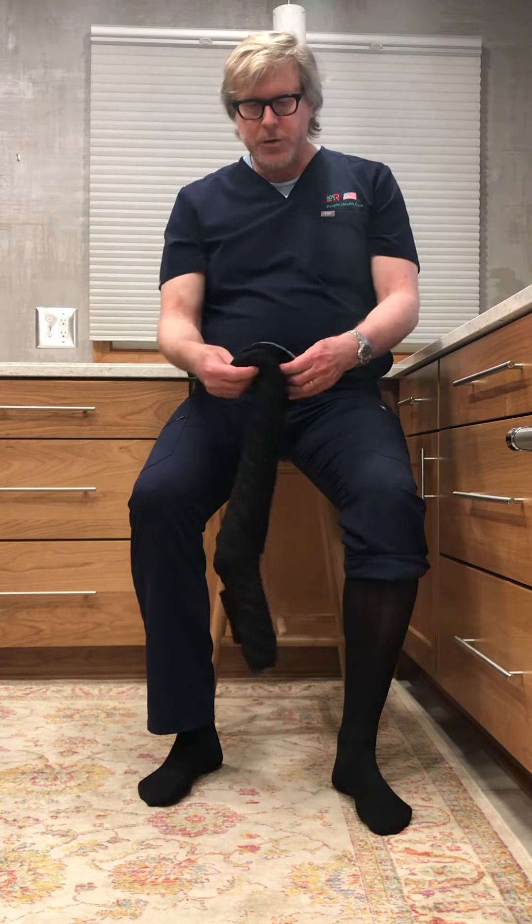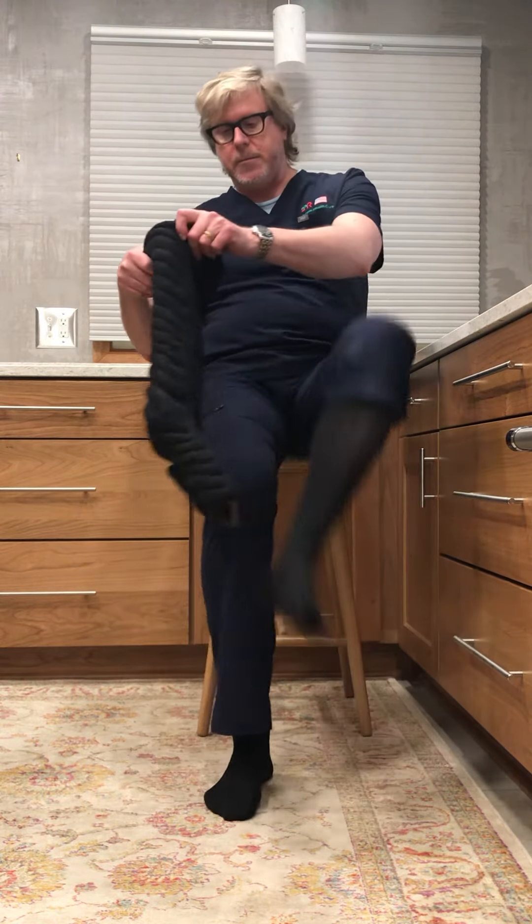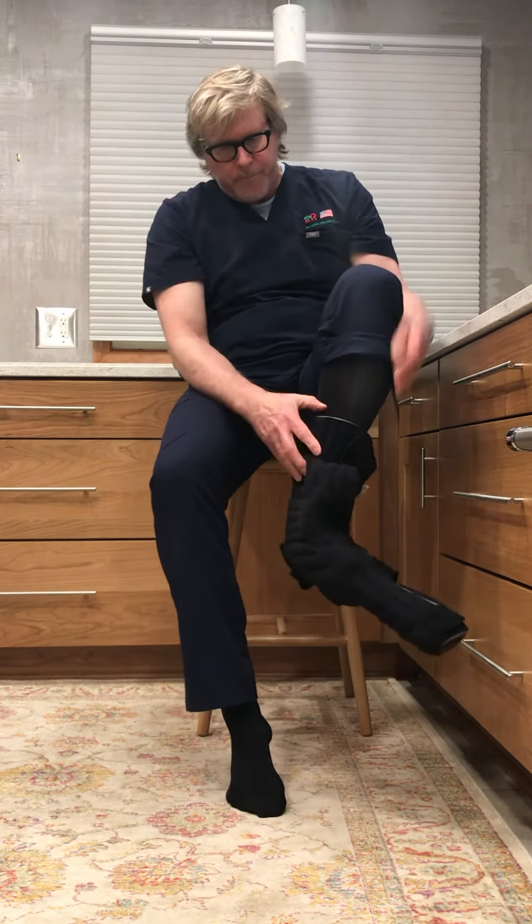Normally you would wear this against your bare skin. Then insert your foot through the wide end of the garment, wearing the Slate Cool Core right against your skin. Get your foot all the way down there.